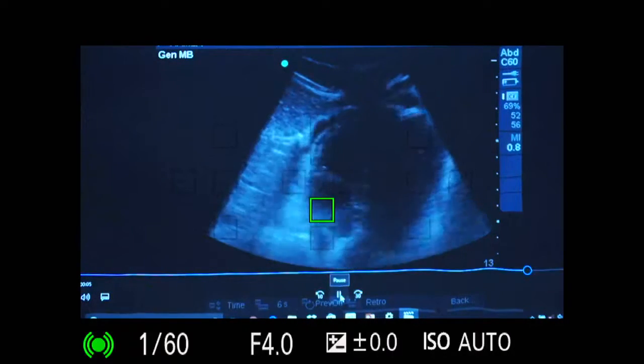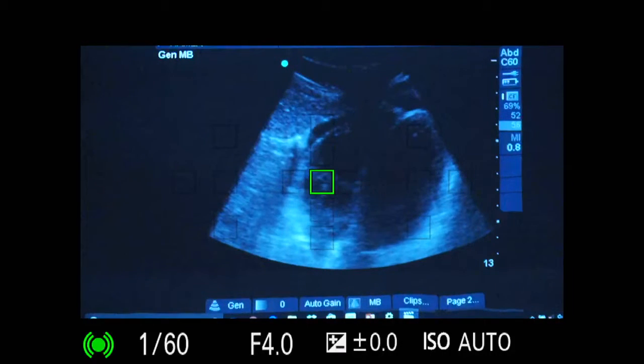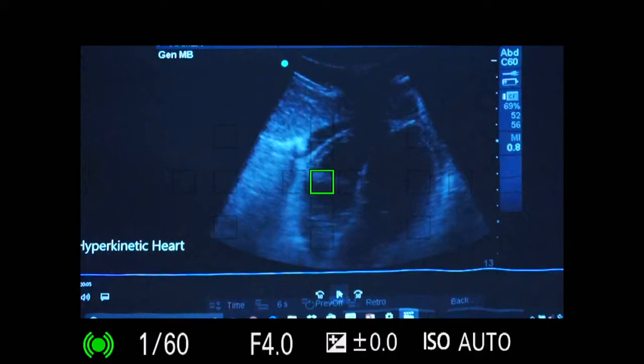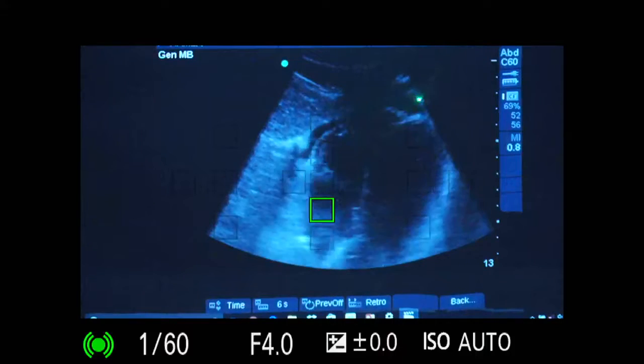Raise your hand. How many of you say there is a pericardial fluid? And the answer is there is no pericardial fluid. So, what you see, the anechoic shadow, it is here only.